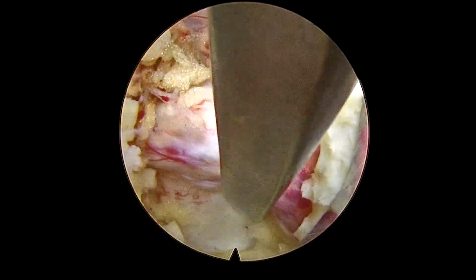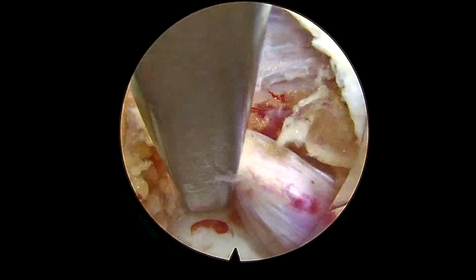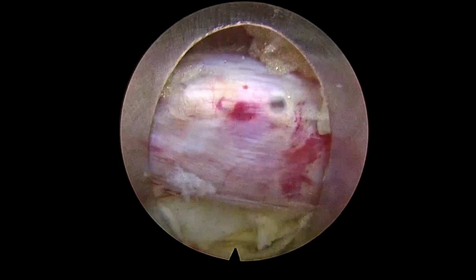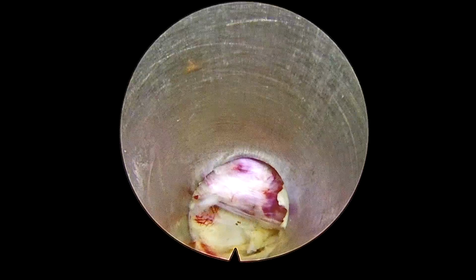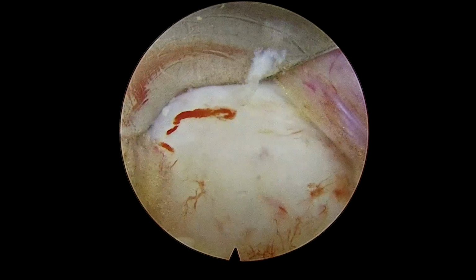So now you can see I can retract the nerve root medially. I think there is enough space laterally. We can dock our working sleeve in the lateral recess and then retract the nerve root. So before retracting the nerve root, try to see whether the root is mobile or not. So we have retracted this root medially.